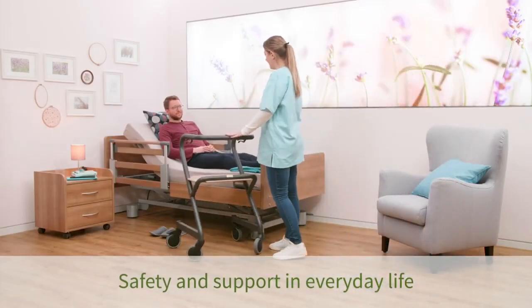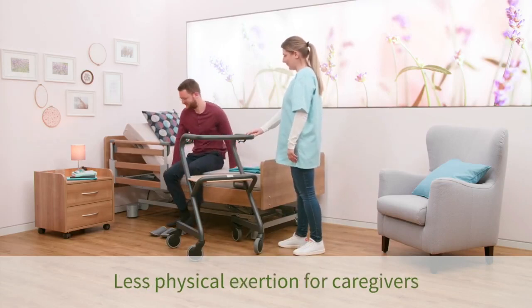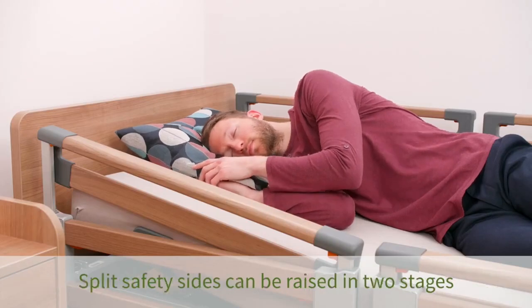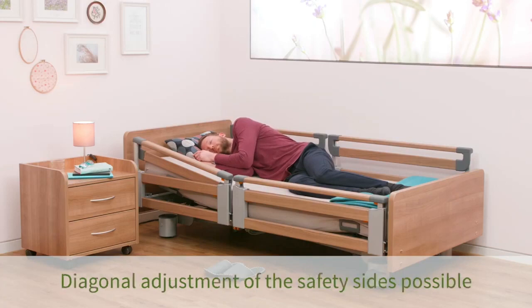Obviously, this is used with a walking aid. And again, I'll show you a wee video that I use my daughters in to show you a hoist, or a stand aid. And these side rails are quite unique in that you can have them halfway up and slanted, and whatever way you feel comfortable with the side rails and whatever they're clinically requested to do.